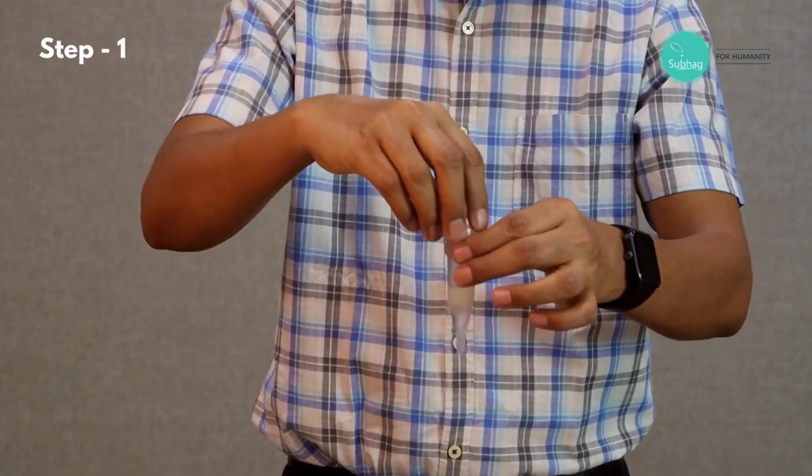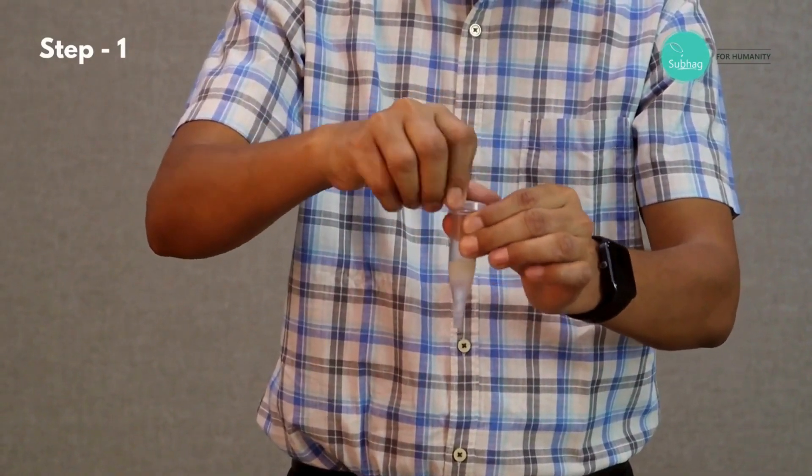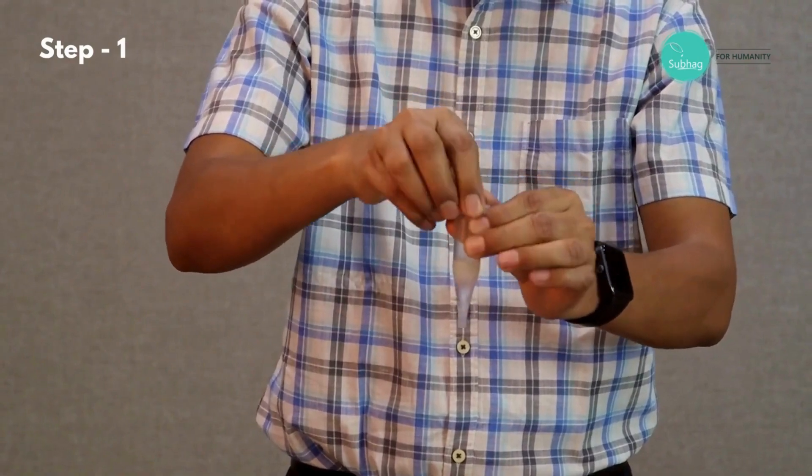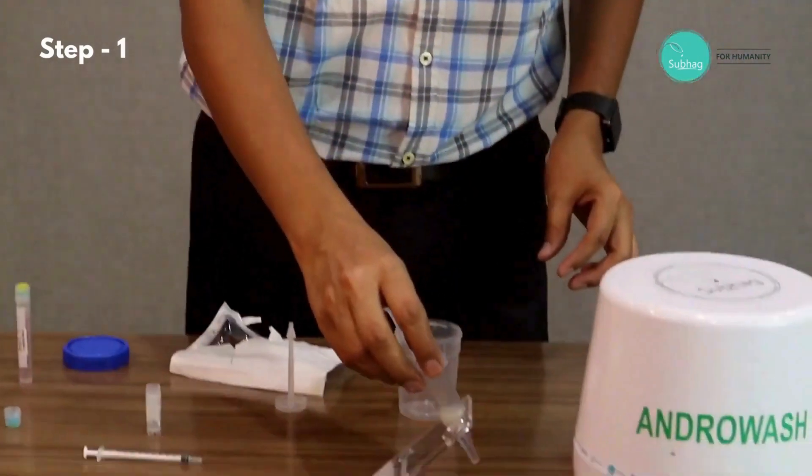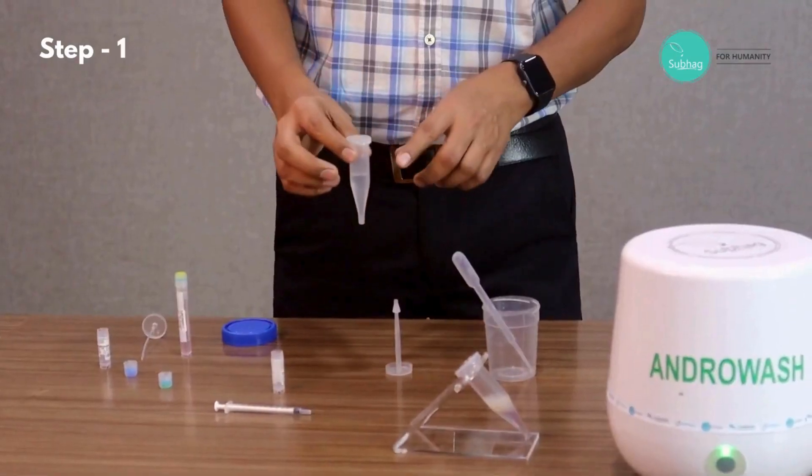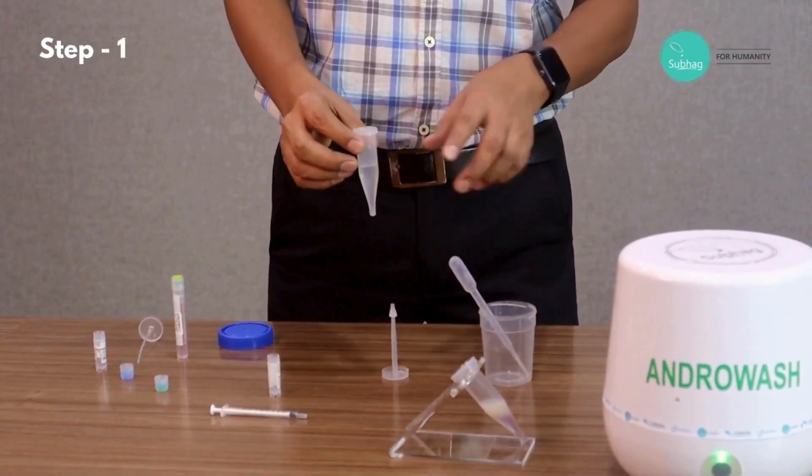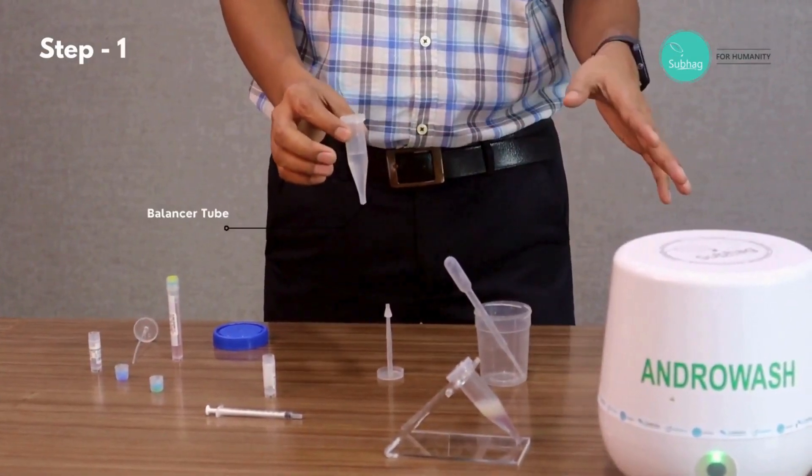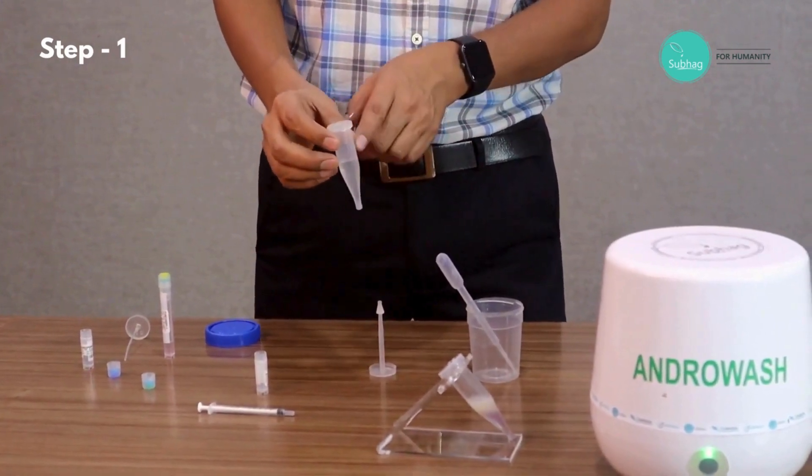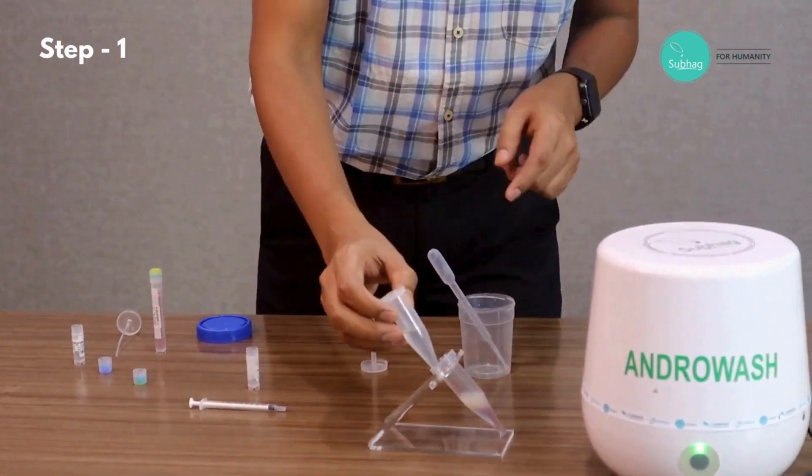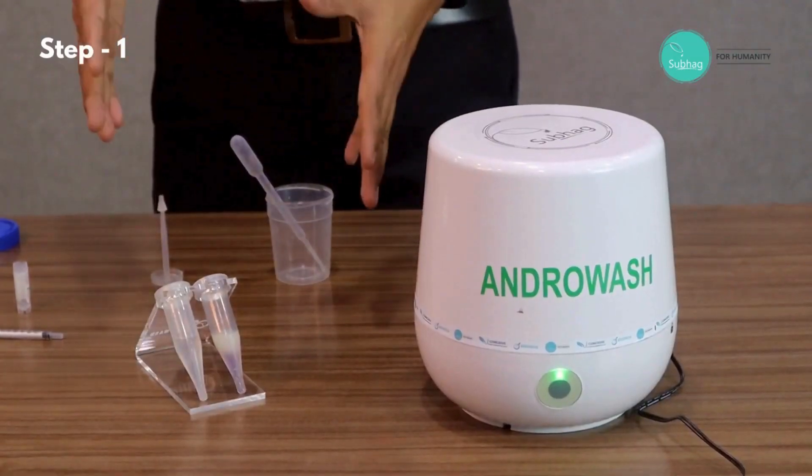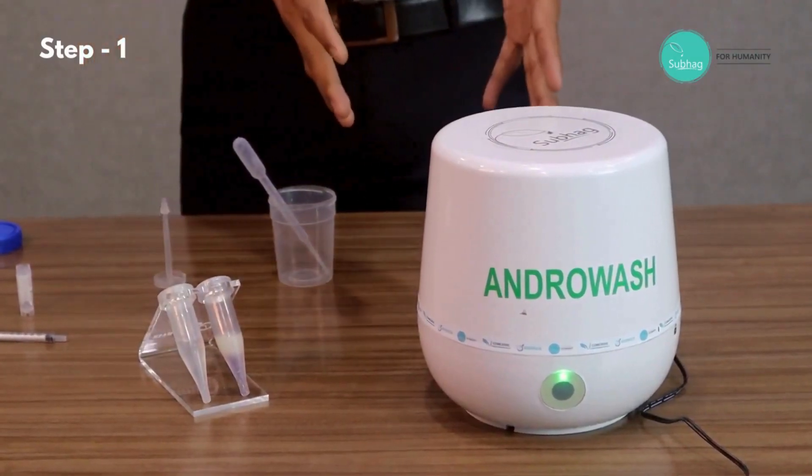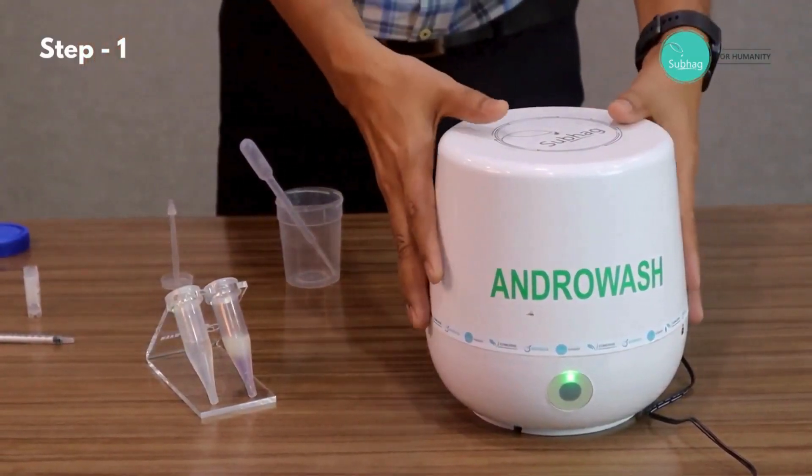Now we take cap two and put it like this, put it on the preparation channel. Now we take the balancer tube. As this is a one wash at a time, we need a balancer tube, so we take the water to the same level so that it's balanced. Now the preparation is done, now it's ready to load into the machine.